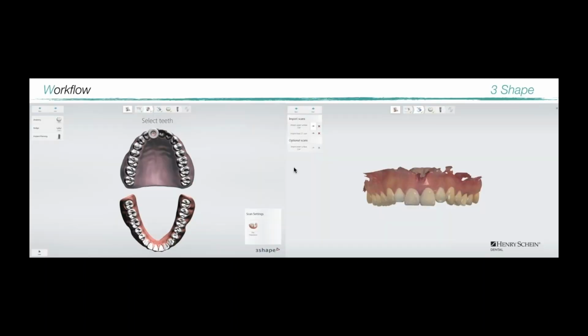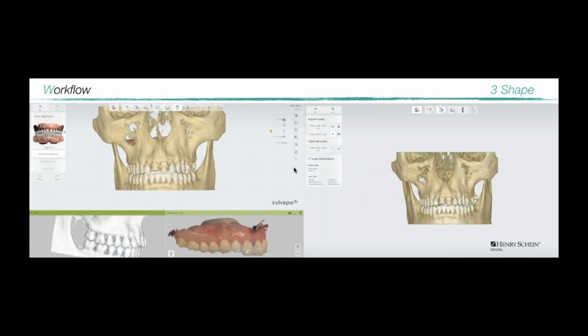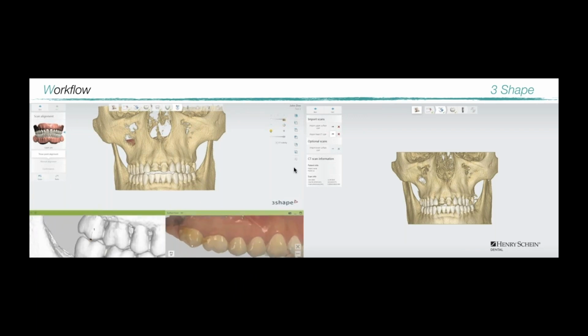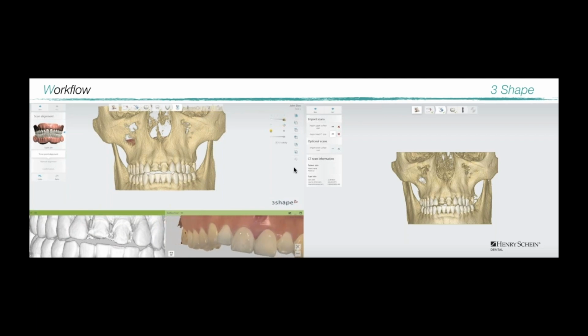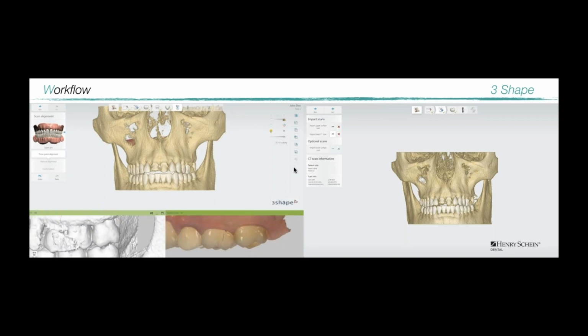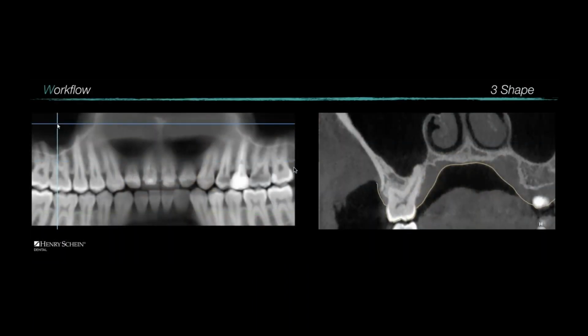Like the case here where we're going to digitize the information. You can see where we've taken the CBCT, we are merging it in software with the intraoral scan. And based off that merger, we now have a surface scan that's very accurate of the hard and soft tissues. We have a bone scan, a CBCT, that tells us very accurately the volumetric area of bone to work with. And now we can make sophisticated decisions about where implants should be, right?